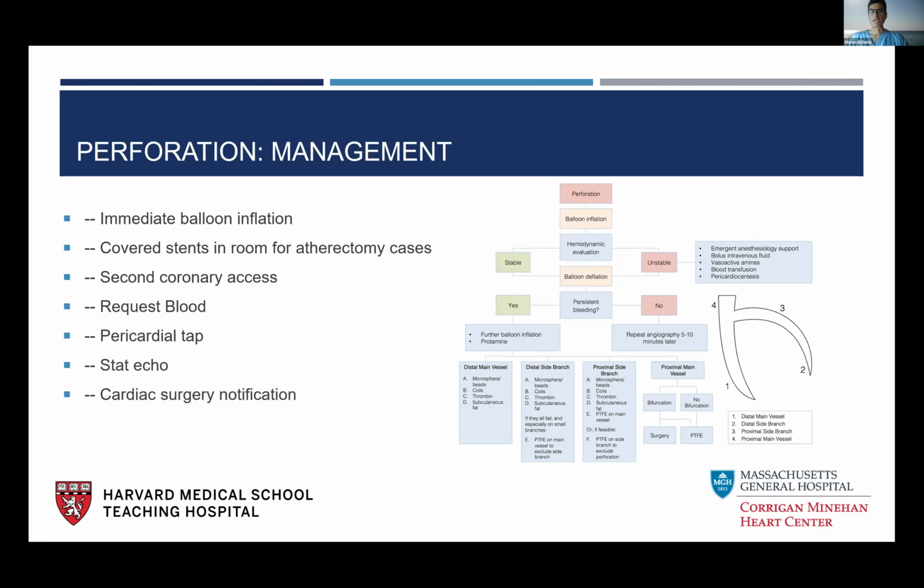Yeah, these are great points. And actually, Papyrus expands better compared with the Graftmaster because it's just a single stent versus two stents. Having said that, I think what you say is reasonable and depends on the sizing of the Papyrus. If you are sized 1-to-1 or more generous than 1-to-1, then definitely you should be careful because, as you said, the vessel can be fragile and might have problems at the edges, but also the perforation might get worse as well. But you should always post-dilate.